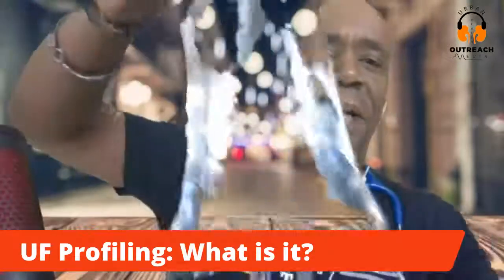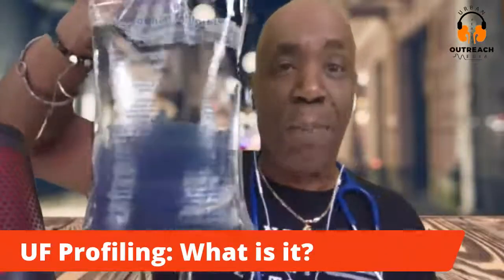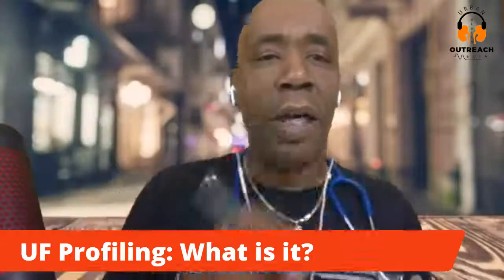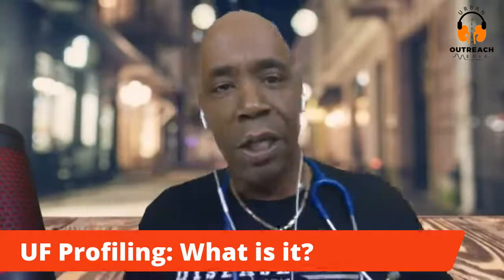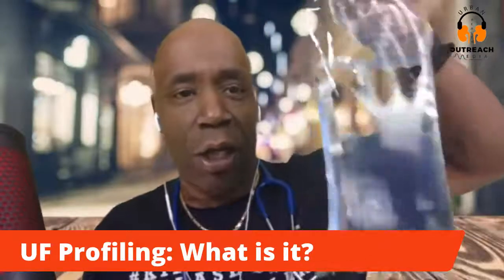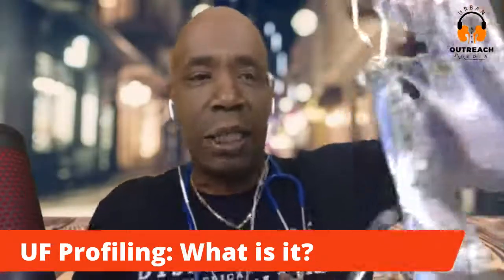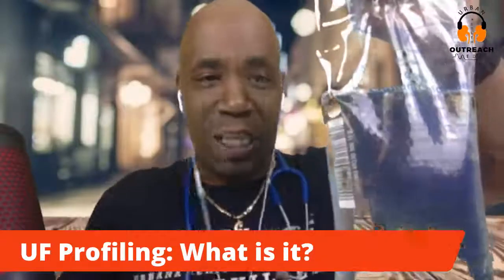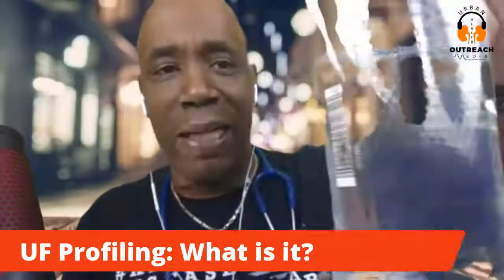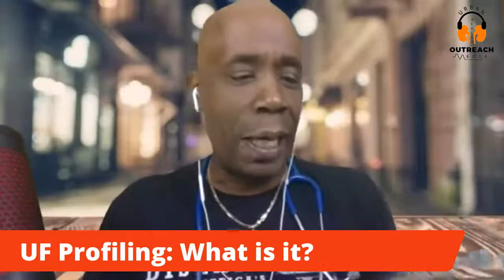And then, as you see, you've got the bag of saline. This is a 1 liter bag, 1,000 milliliters, of saline. If you hear that expression, if you're at dialysis and your blood pressure drops and you pass out and you hear somebody say, "Go get the saline, go get the saline," this is what they're talking about right here. This solution is compatible with the solution in your body. 0.9% sodium chloride solution has the same electrolytes that are inside your body, and this is what we use.